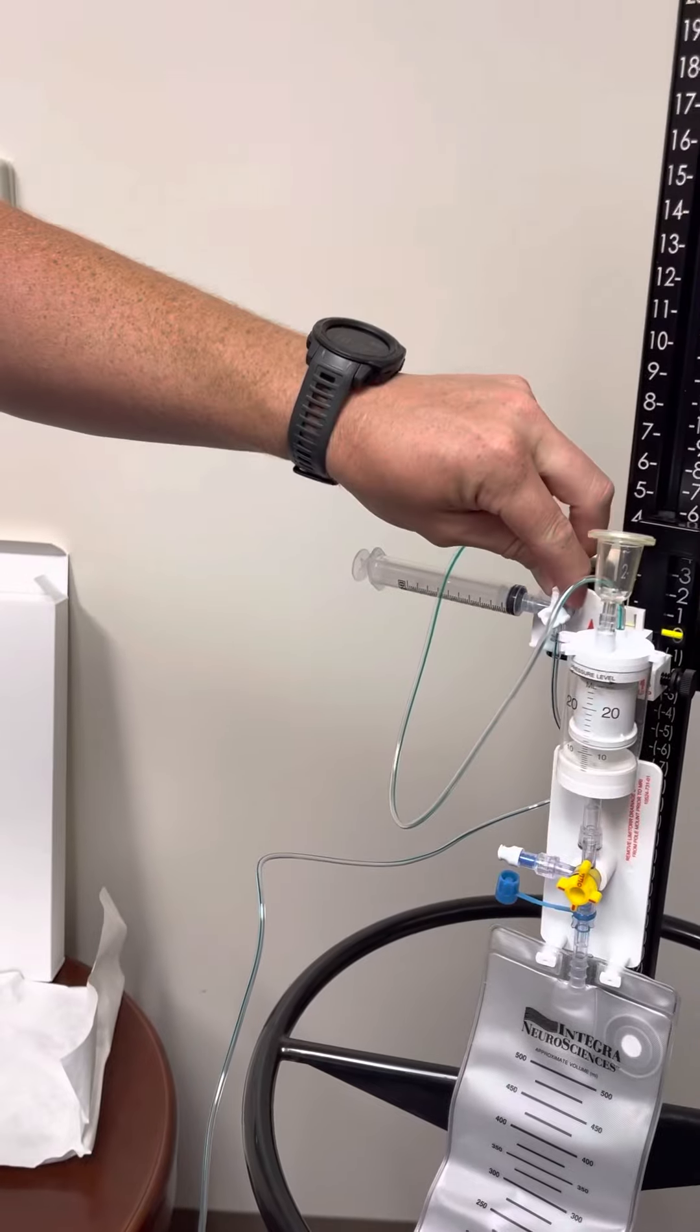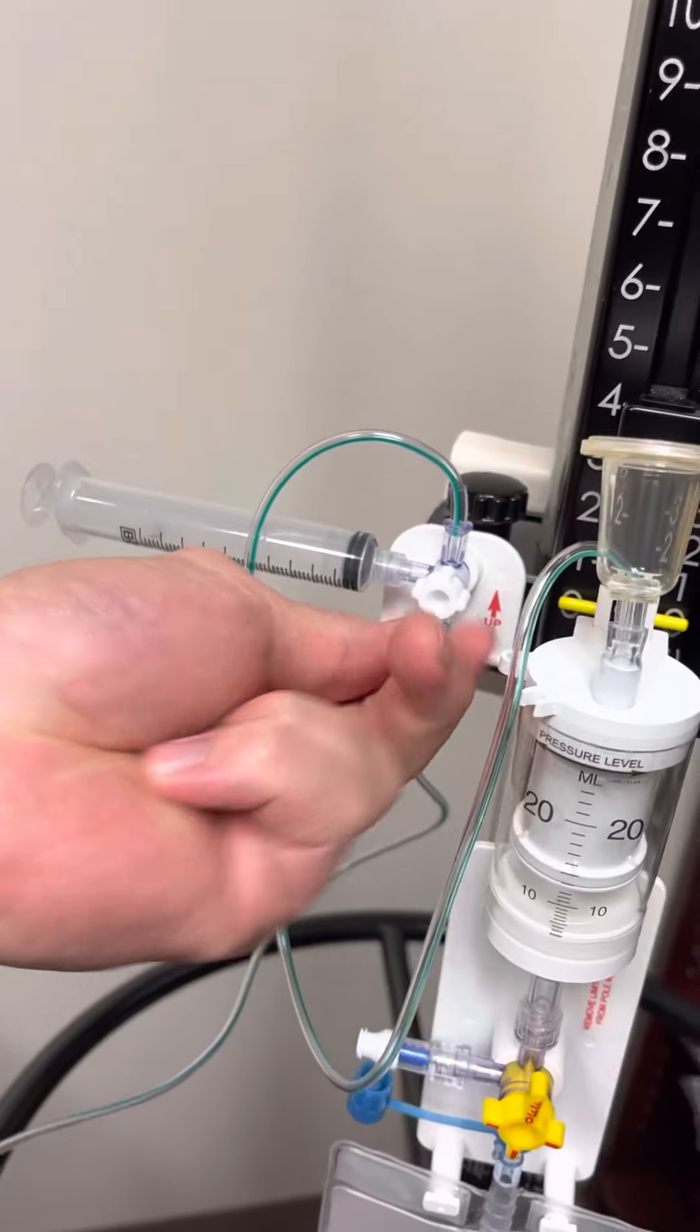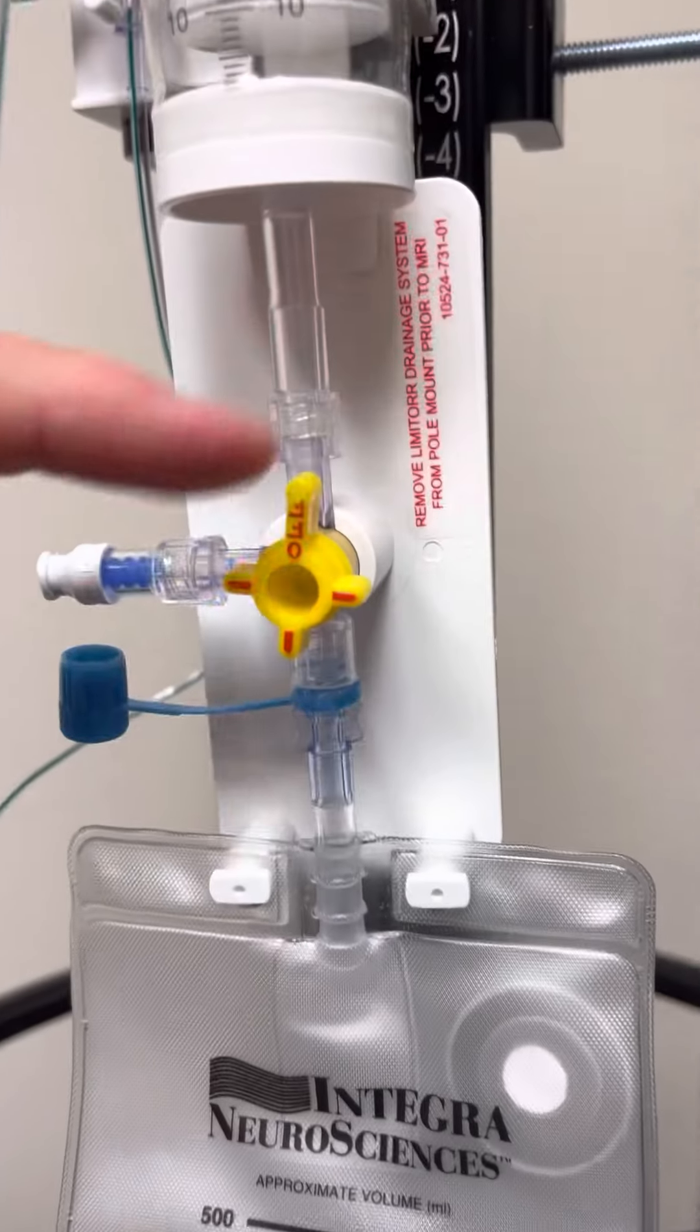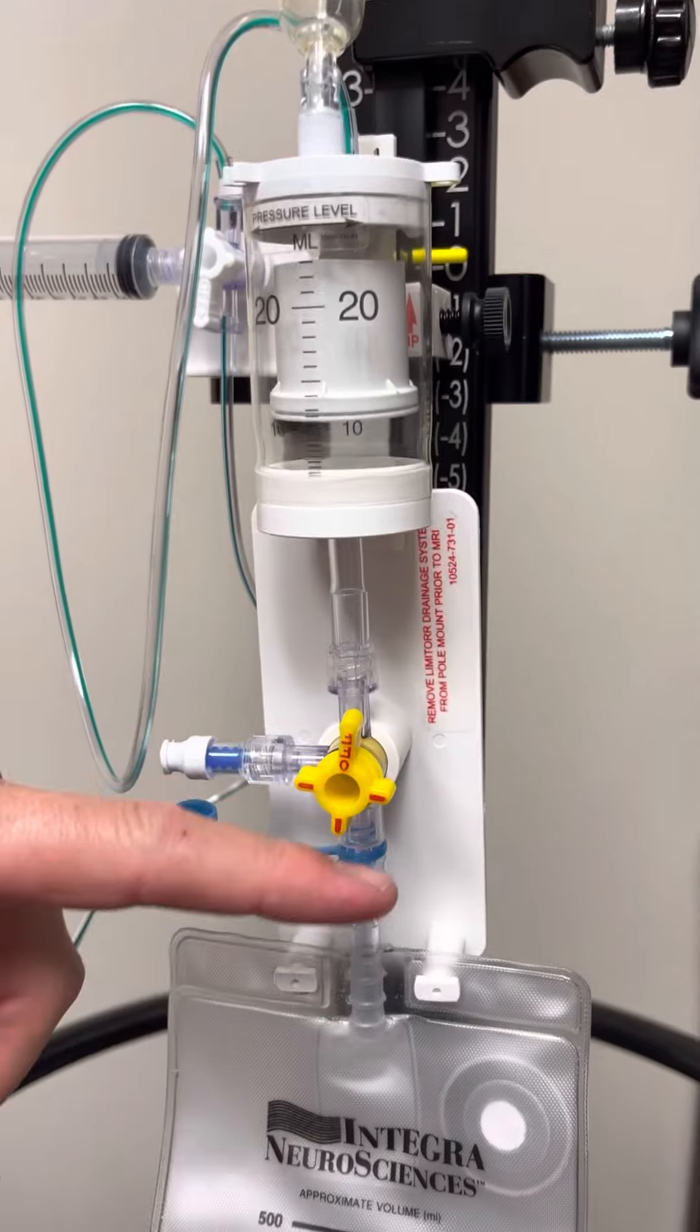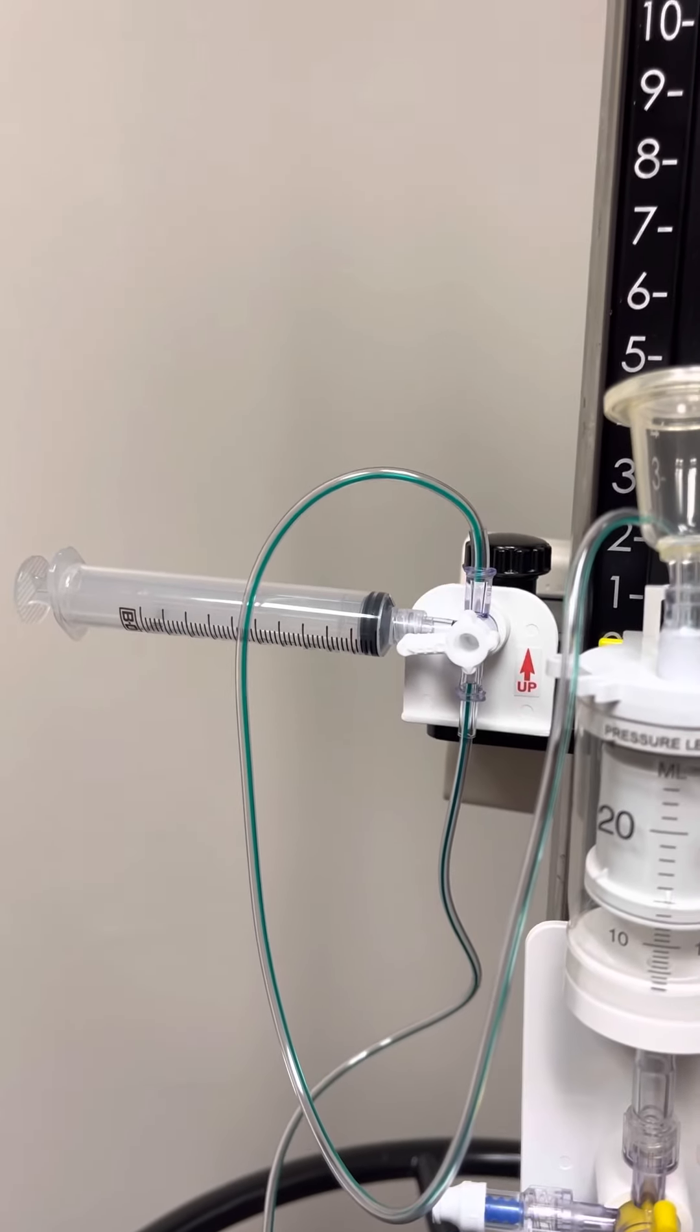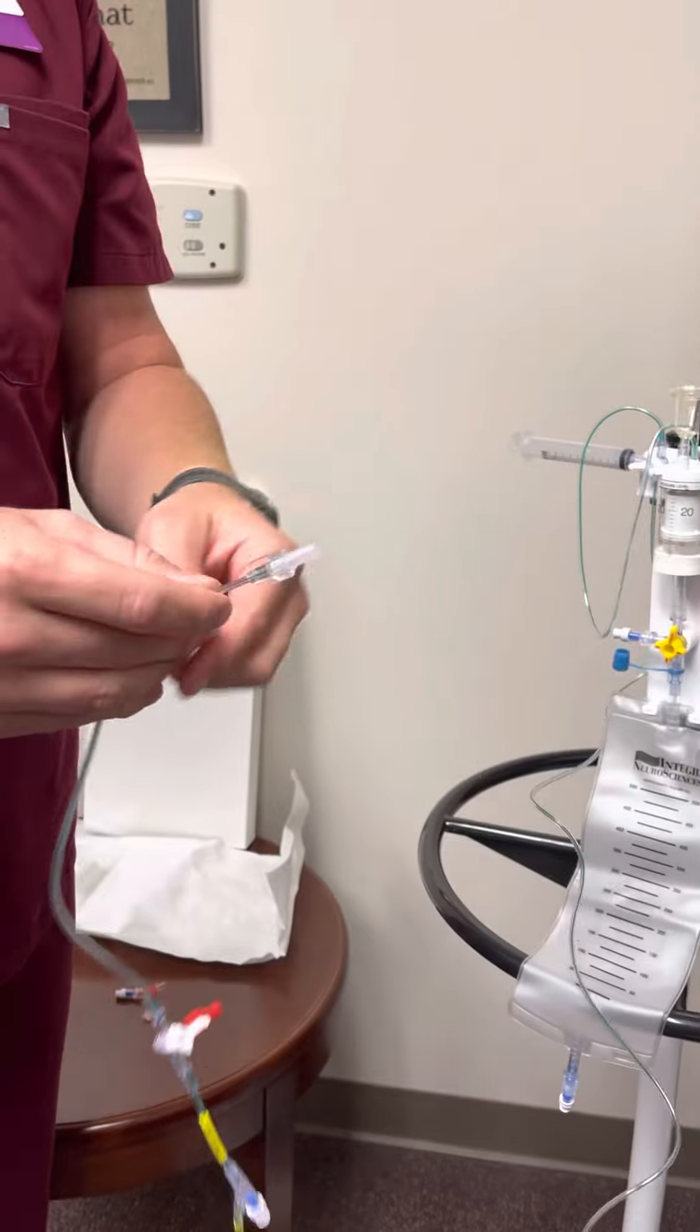I like to just prime out first. As soon as you see fluid dripping from here, turn the stopcock down. Prime so there's no air in this system. Making sure that this valve is turned up so when you're priming this burette, your fluid is not all going down to the drain bag. When the system's primed, you turn the stopcock back off. This is when, if you are at bedside, you would hand it to the provider and they would connect it to the lumbar drain.